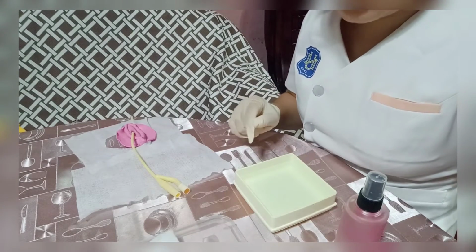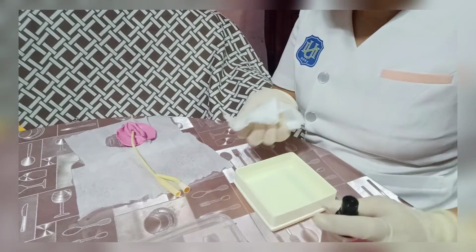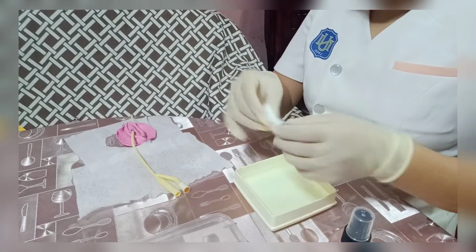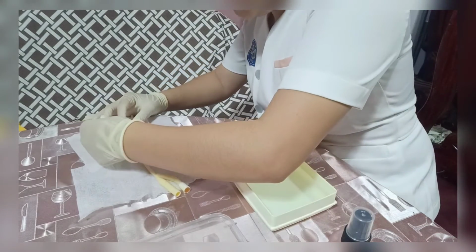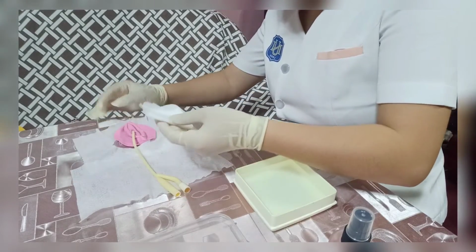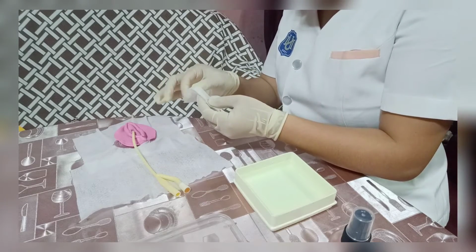Let's get a washcloth, then put soap. Clean the labia, and one side of the washcloth is used each stroke. Let's fold, then clean the other side.